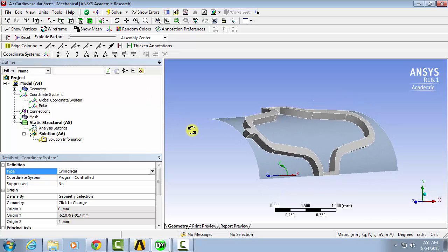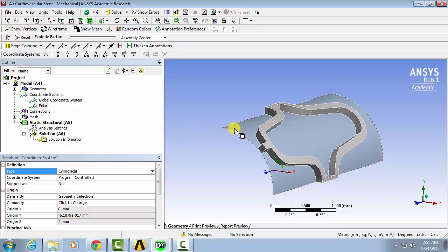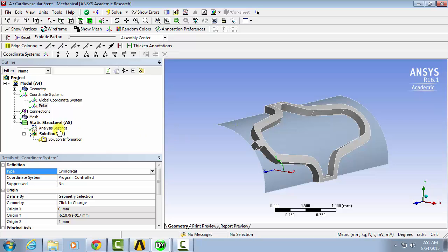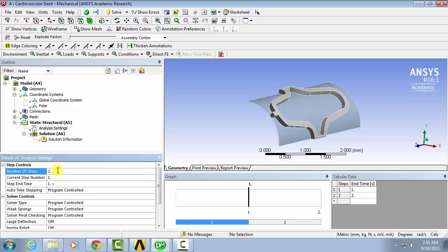Now, the way that we're going to define the displacement in this problem is we're going to displace the balloon a certain distance radially, and then we're going to contract it again, and then let the contact separate, and then let's see what happens when the stent is free. So in order to do that, we have to create two time steps. So we'll go to Analysis Settings, and then we'll select Number of Steps as 2. That way we can expand and then contract.